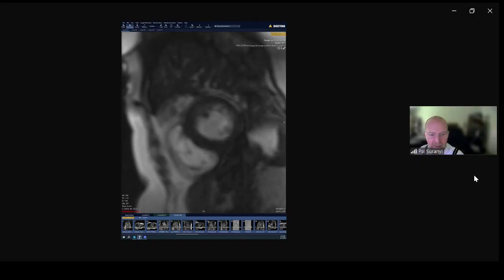I'm just trying to see the indication here. Chest pain, and they were hearing some murmur, and they were wondering if the patient has a patent ductus arteriosus, like a sort of a continuous machinery murmur, and has history of hypertension and presented with chest pain.